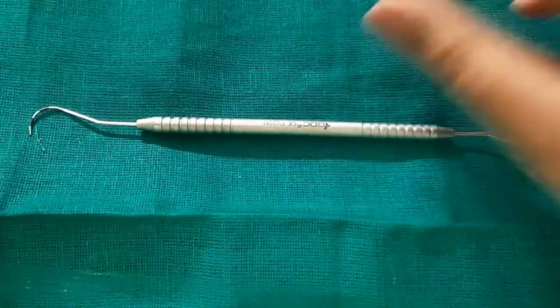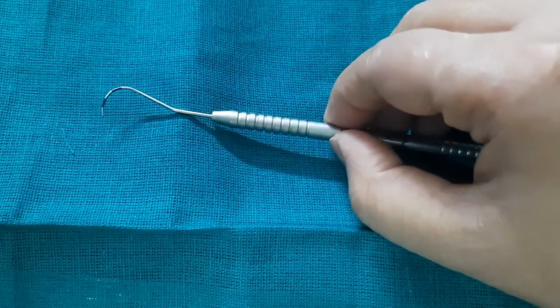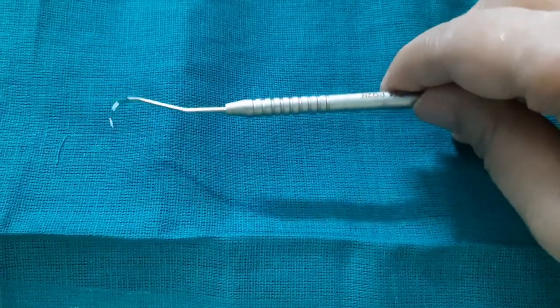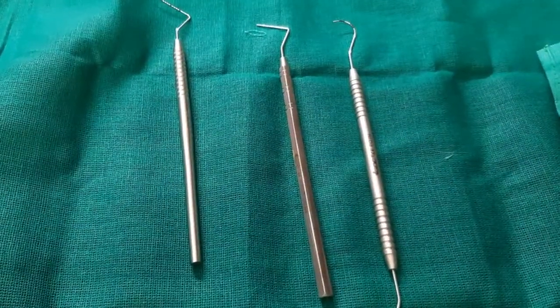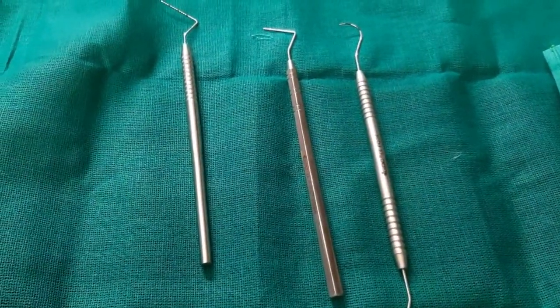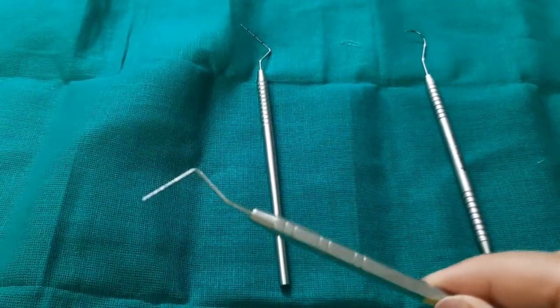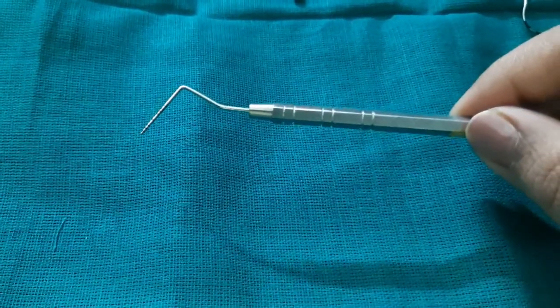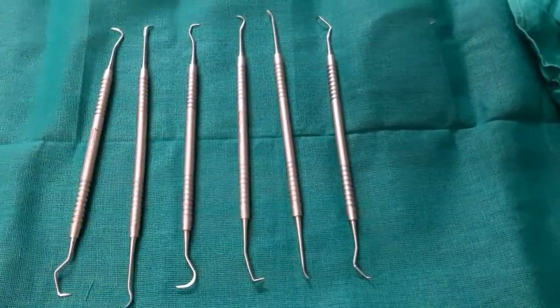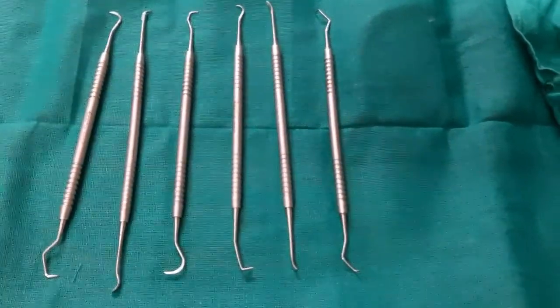The third probe is the Nabers probe, which has markings from 1 to 12 millimeters with color coatings at 3 and 6 millimeters. The Nabers probe is basically used for measuring furcation areas. All periodontal probes are used for measuring pocket depth, and especially the Nabers probe is used for measuring furcation area depth. Sometimes probes are also used for detection of bleeding — if there is bleeding on probing, it can indicate a case of gingivitis.